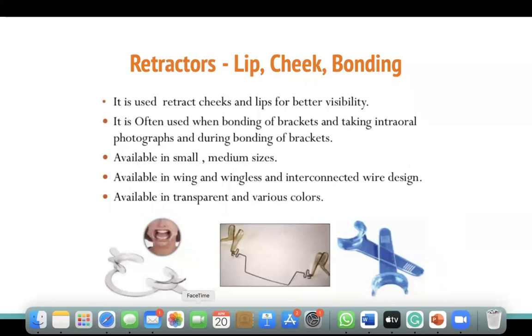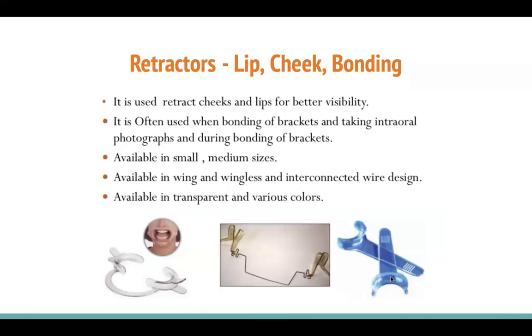You need three types of retractors: a lip retractor for taking occlusal photographs, a cheek retractor for side view pictures, and a bonding retractor — available in two styles — to help put braces on. These retractors are used for better visibility during bracket bonding and taking photographs. They're available in small and medium sizes, in wing and wingless designs, and in interconnected wire designs that also serve as tongue retractors. Available in transparent or various colors.